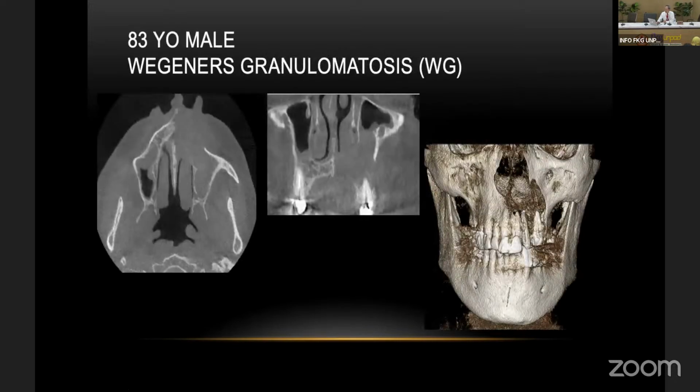Now, in the sinus or nasal cavity area, when you see destruction, it is almost always one of two things. One is Wegener's granulomatosis. The other one is malignancy. As a matter of fact, if you see a scan like this, a combined CT like this one, my first impression would probably be malignancy. But the biopsy turned out to be Wegener's granulomatosis.